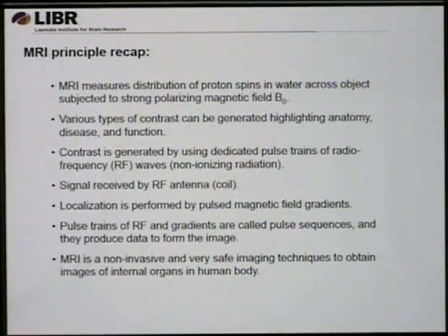So this is the MRI principle recap. Essentially, what MRI does is measure the distribution of proton spins in water across the object, and vastly different types of contrast can be generated with this technique. And it's completely non-ionizing, it utilizes non-ionizing radiation. So it's very safe. It's just RF waves, which are actually all around us here.